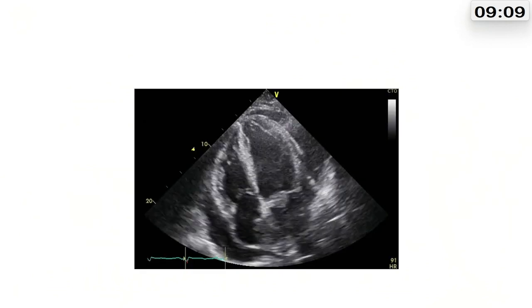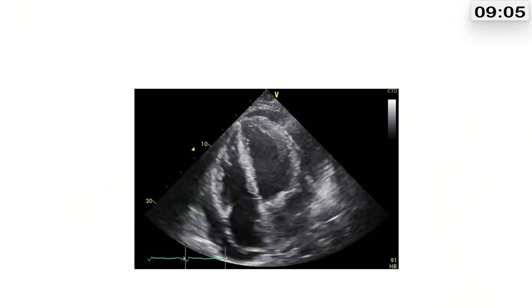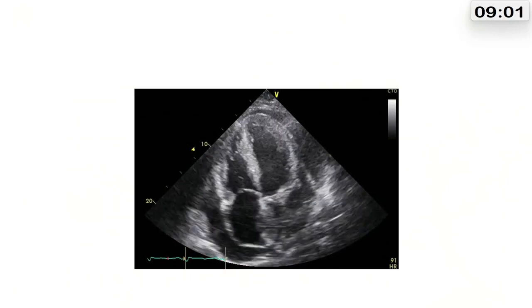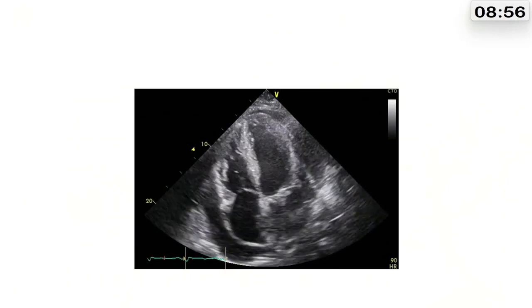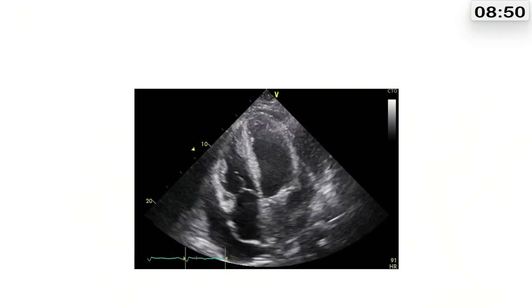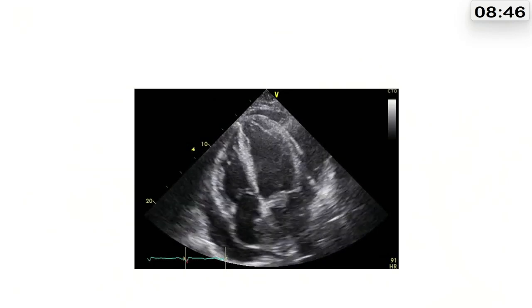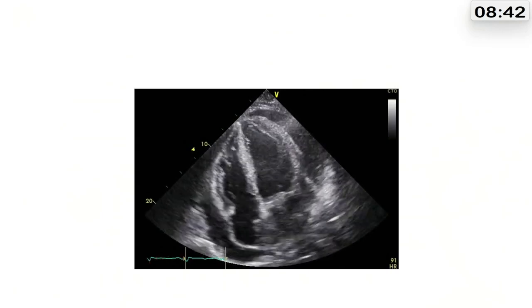So what I did, I chose 3 cases admitted last month to my place, and asked your help to tell me if we got the right ventricular assessment right or wrong. This is the first one. This is a patient I was called about in the middle of the night by my registrar, saying, well, we don't know if the patient is tamponading or not. We know there is effusion. We know that the left ventricle is very clearly not working, severely impaired. But the RV, I'm not really sure if it's impaired, not impaired, hypertrophied, tamponading, not tamponading.